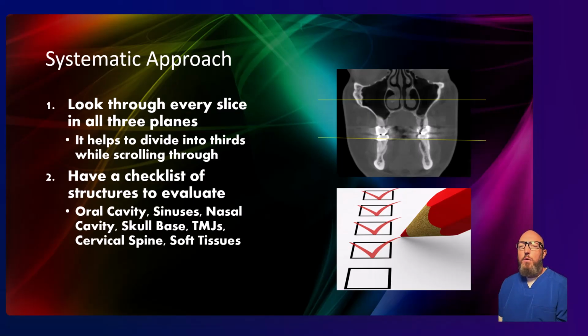I can send you a checklist that I made early on. But basically, if you don't feel comfortable doing this for every CBCT you order, that's where you refer to a radiologist. There are many radiologists that read CBCT scans for a reasonable fee.